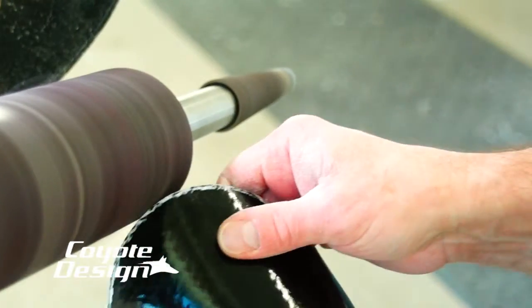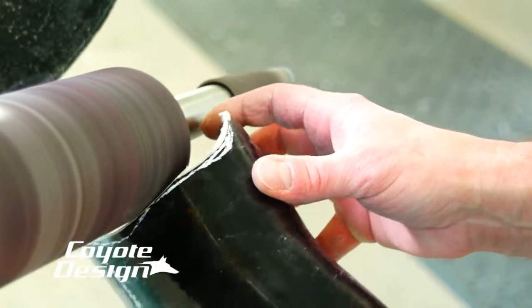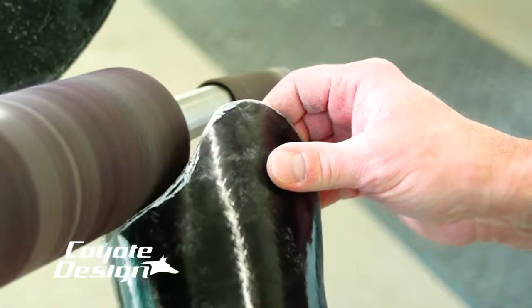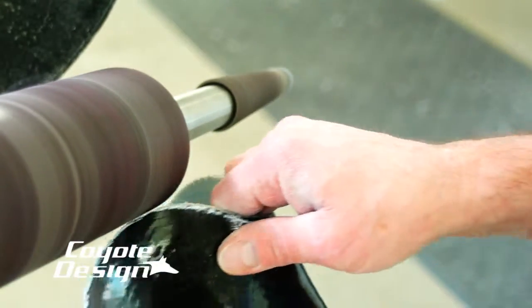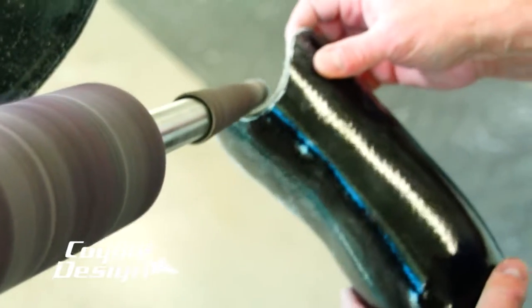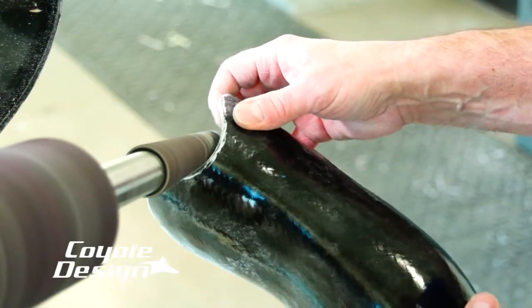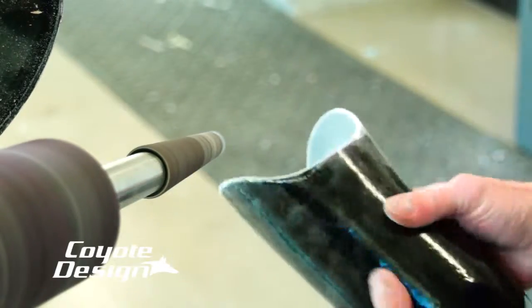I sand my coyote composite almost the same as I do plastic or any other carbon socket. I turn the wheel on high, run across my inside edge and outside edge, then get ready to polish it. If you're having trouble with it cutting and being too abrasive, go ahead and run your wheel on slow and try going with the wheel when you cut your coyote composite — you'll find it takes less off and stops it from being wavy.